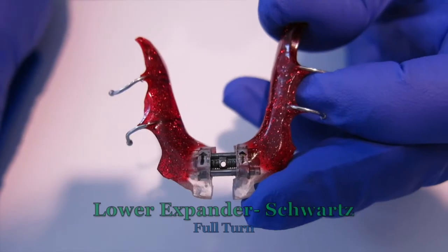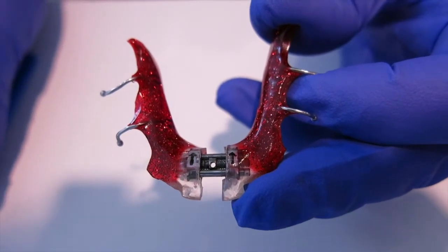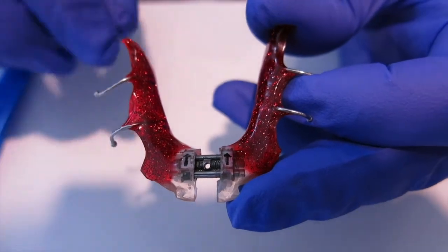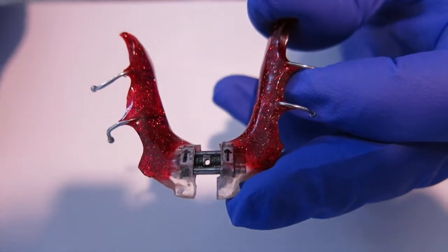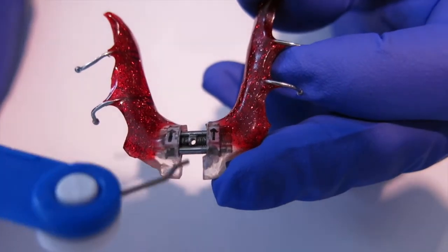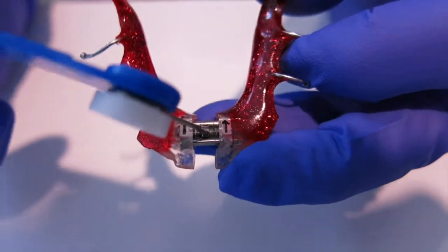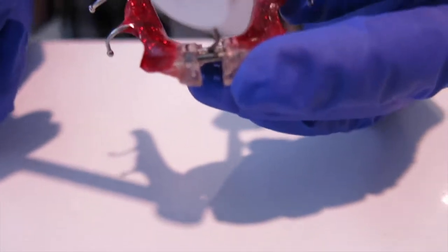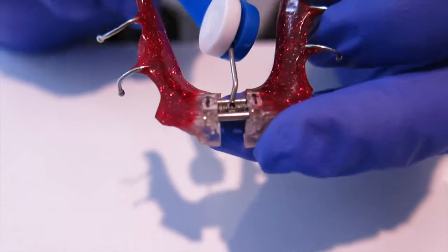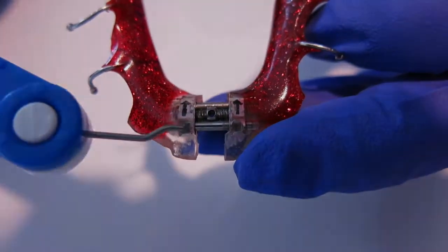Now I'm going to teach you how to turn your bottom expander. To remove your expander, remove it using the back clasp. If you can't use your clasp, use the acrylic. Now to do a full turn, take your key and place it in the hole closest to where your teeth are, right in the front. Do a full turn, bring it all the way to the back. And a new hole should appear in the front.